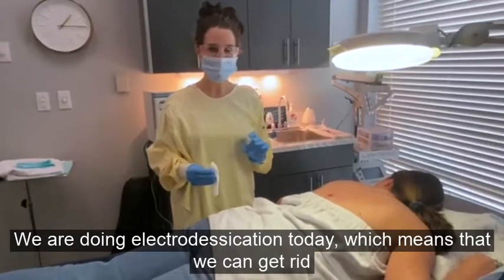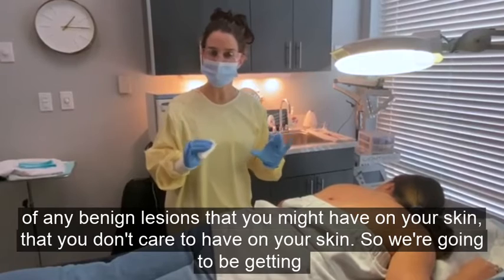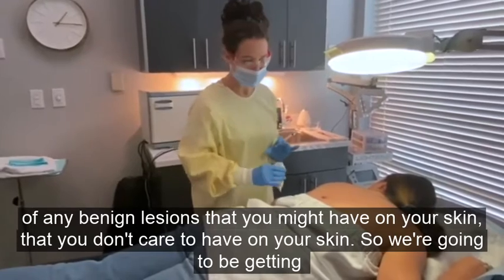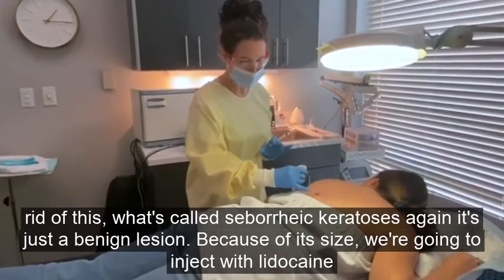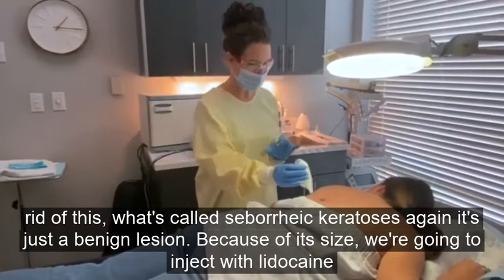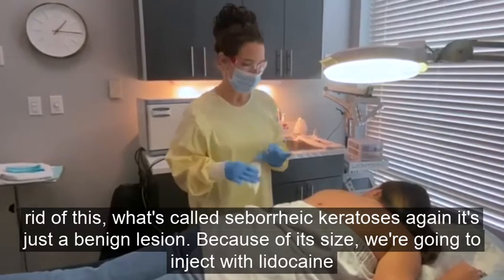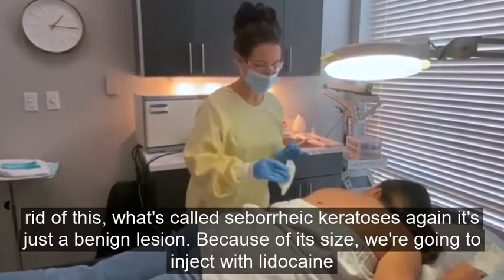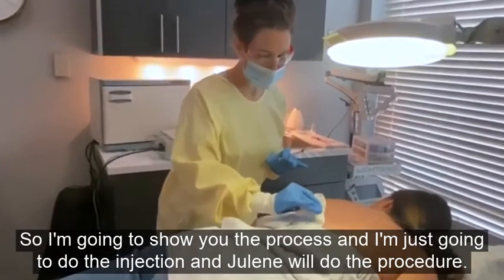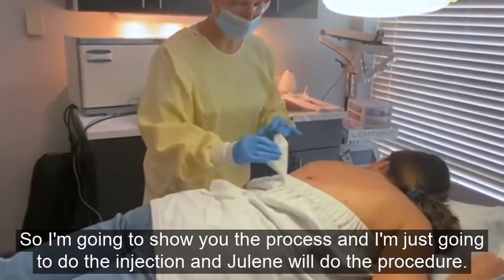We are doing electro desiccation today, which means we can get rid of any benign lesions on your skin. We are going to be getting rid of this seborrheic keratosis — it's a benign lesion, but because of its size, I'm going to inject it with lidocaine. We like to be kind to our patients, so I'll show you the process. Then Julene is going to do the electro desiccation.